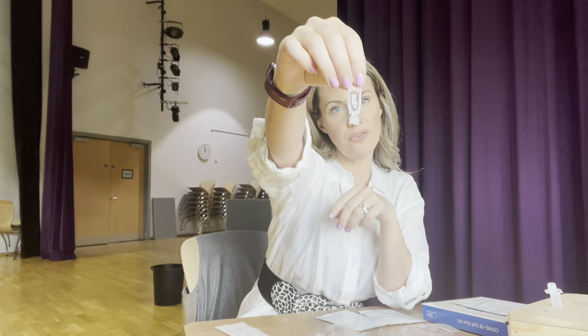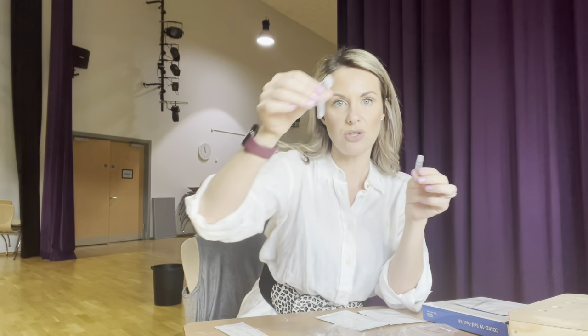I'm going to make sure I've got a flat surface and lots of space to put everything out in front of me. I've washed my hands for 20 seconds, and the first thing I'm going to take is the extraction fluid and the test tube.